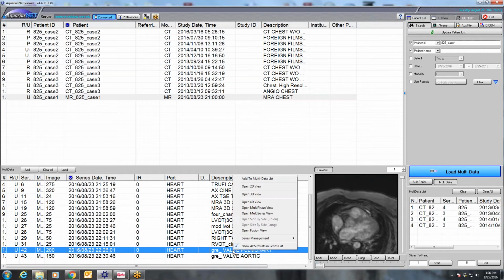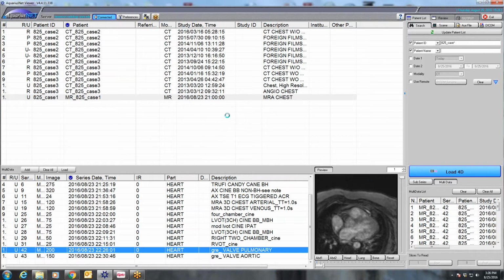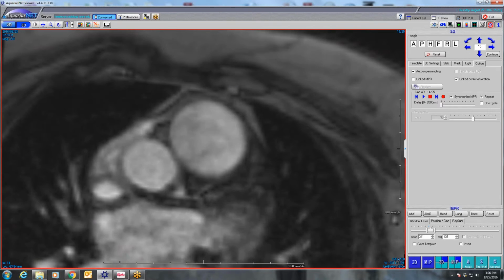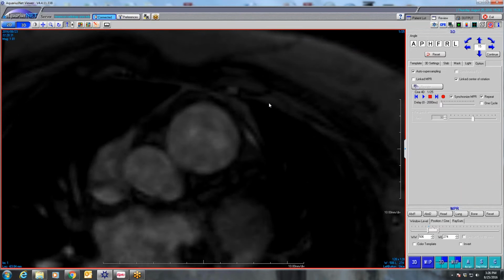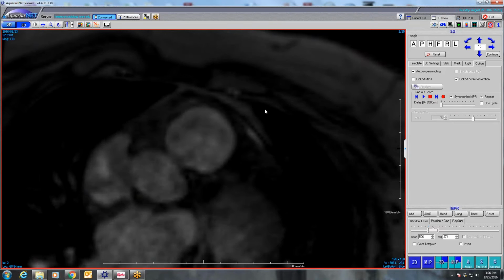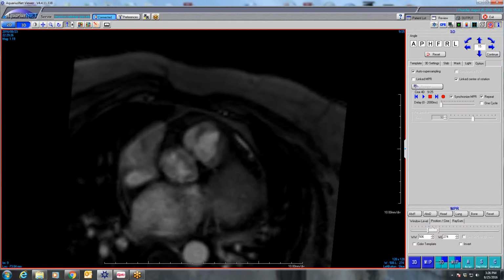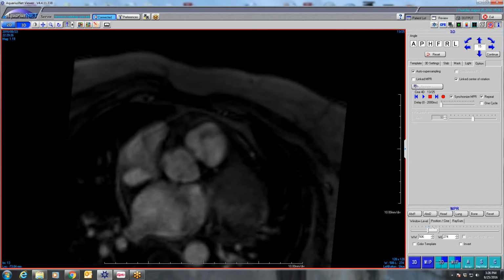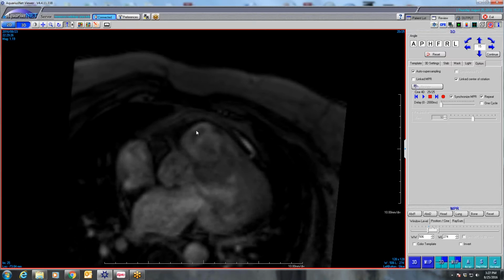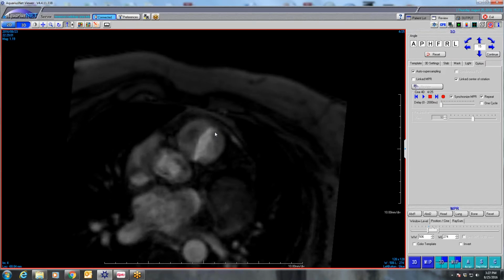Now, this is just a nice case that we had yesterday or 2 days ago of a woman who has aortic stenosis and is undergoing surgery for her aortic valve soon, and they noticed that her pulmonic valve was kind of strange looking and her pulmonary artery enlarged. You can see this woman has a bicuspid pulmonary valve with fusion. This is the left, this is anterior, this is right. There's a little fused raphe down here between the anterior and the right, forming a nice bicuspid valve.